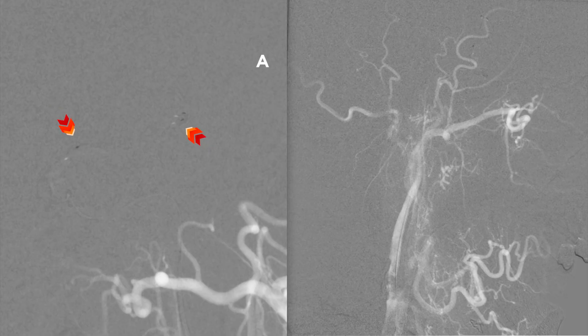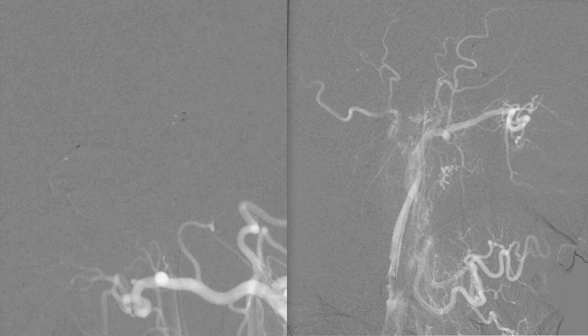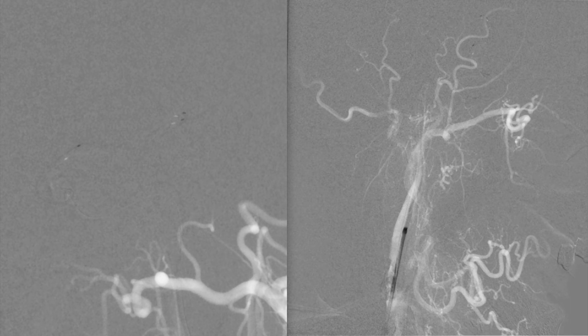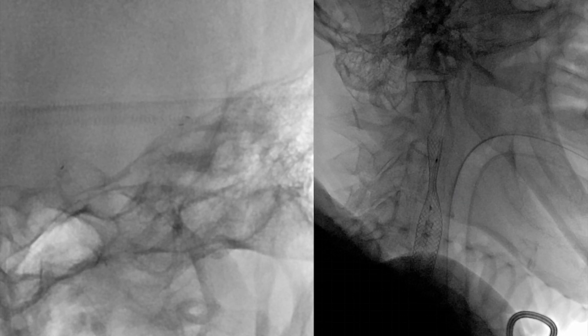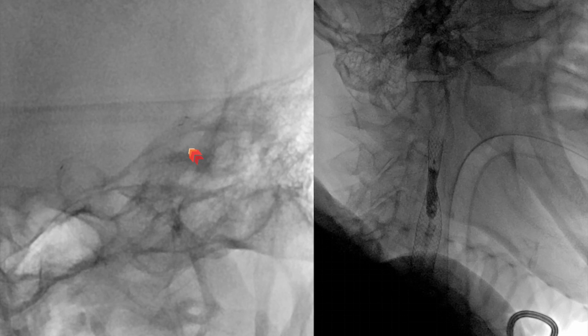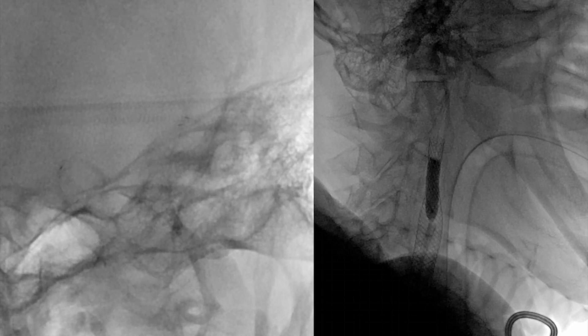While performing this technique, it's important to keep an eye on the stent retriever. I usually focus the A C-arm on the stent retriever and use the B C-arm — the lateral C-arm — to treat the cervical lesion. You can see here the roadmap while doing the revised technique. I then push the carotid wall stent and deploy it in the cervical lesion. The next step is to exchange the carotid wall stent for a PTA balloon — in this case a Sterling balloon — and treat the cervical lesion with angioplasty, while the stent retriever remains up in the M1 segment, incorporating the clot.